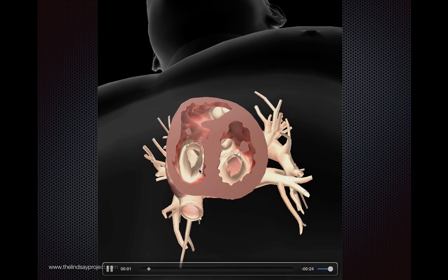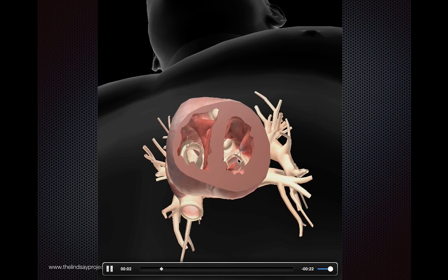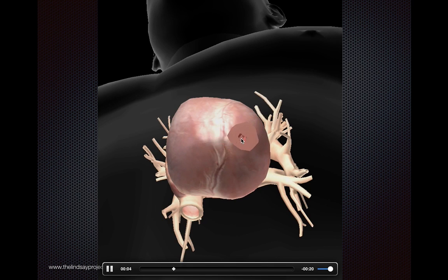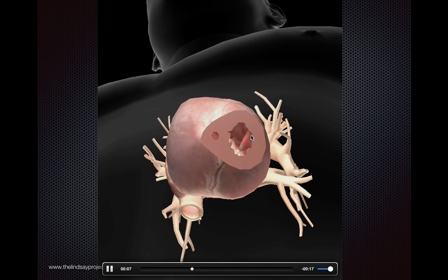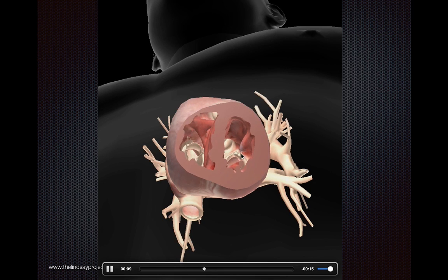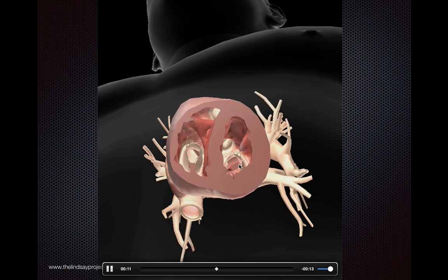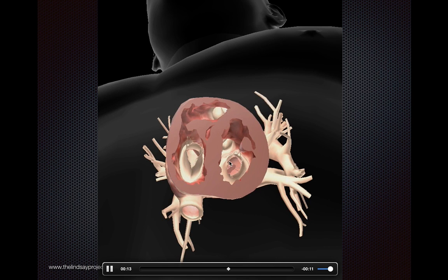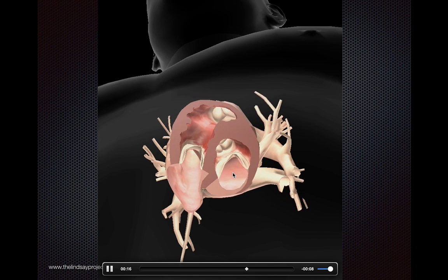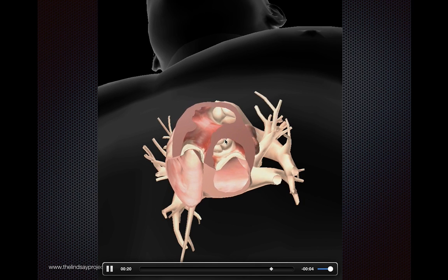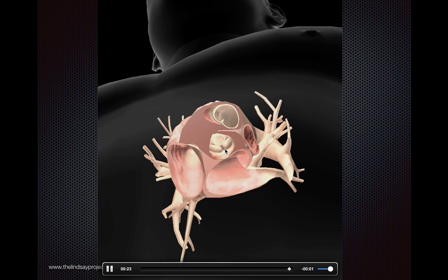Anatomically, these are some of the structures you're going to see. You have your mitral valve and the papillary muscles. As you look towards the apex, the ventricle should get smaller. As you tilt back up, the first valve you should hit is the mitral valve, which is a bivalve — we call that the fish mouth view. As you tilt up even further you should start seeing the aortic valve, which is a tri-leaflet valve unless you have a bicuspid aortic valve. Your right side of the heart is on one side and the left side is on the other.